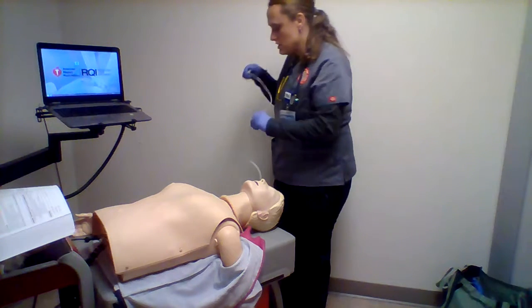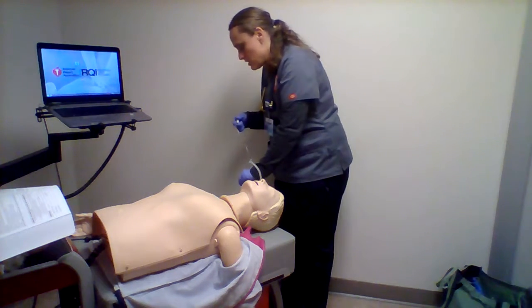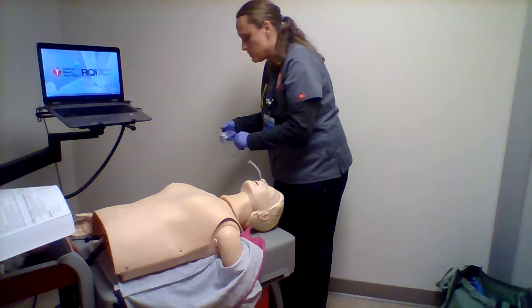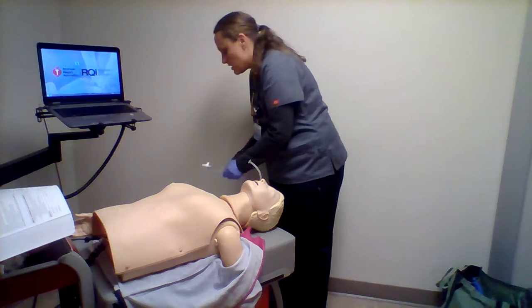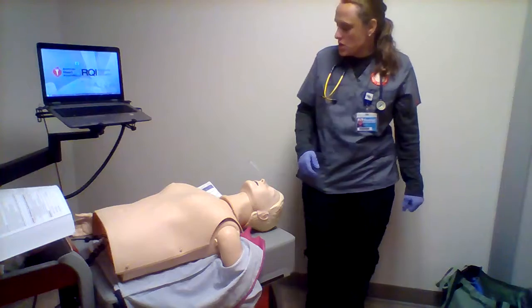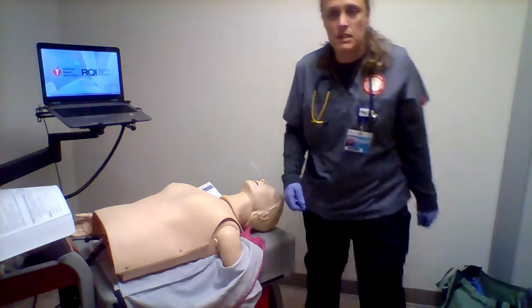Try not to touch the end. Suction some water out to clear all the tubing. Then either dispose of this or keep it as sterile as possible. Some people reuse them just because of patient cost. So that's it. Thank you.